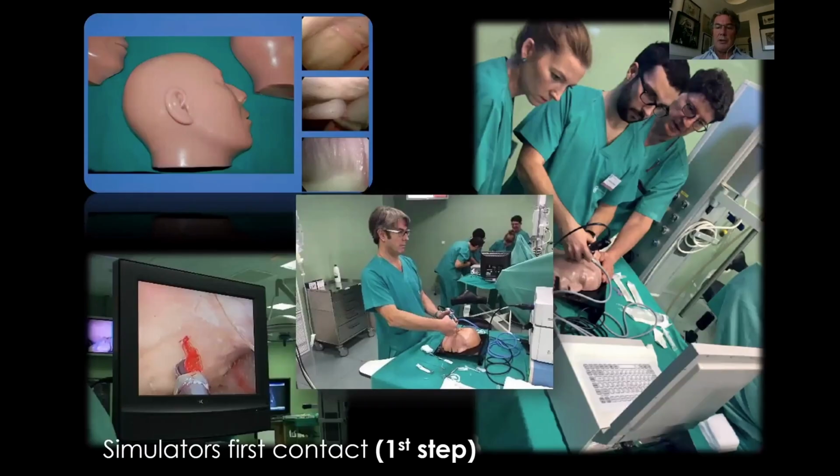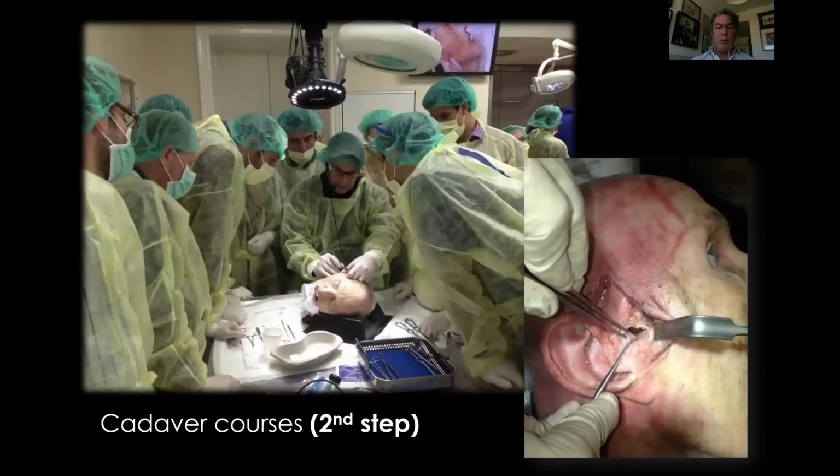Then the first step should be to start practicing on some simulators. This is the first and the best, designed by Dr. Florencio Monge here in Spain. It's very useful to have the first contact with them. Then you can move to the second step. The second step is the cadaver course. We have very good cadaver courses.